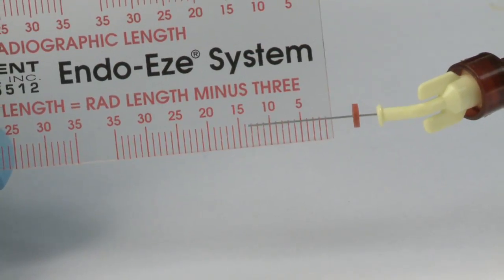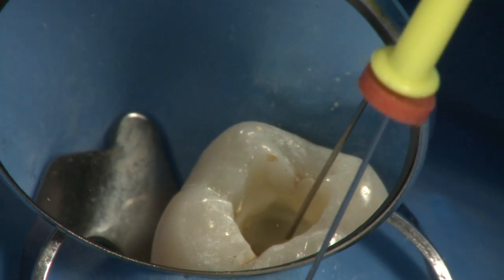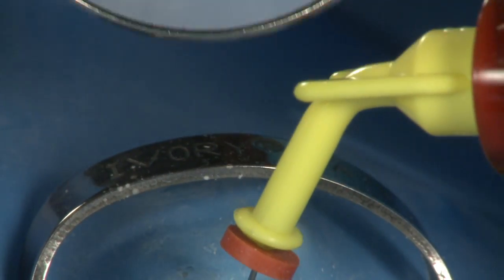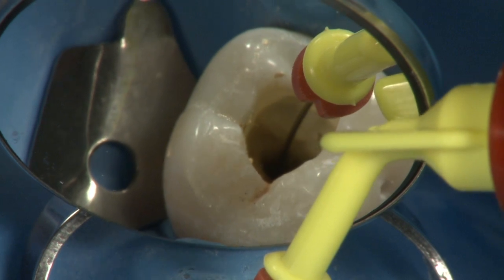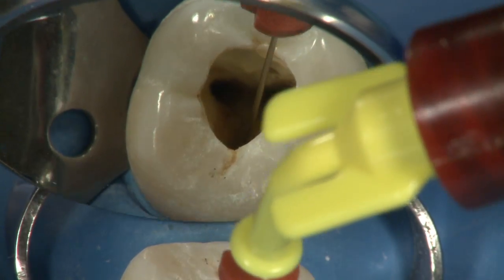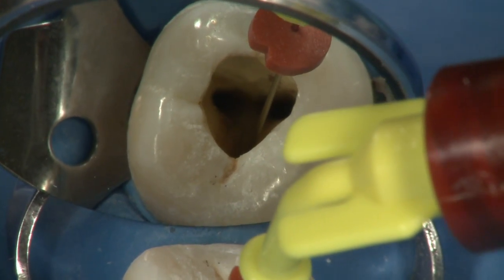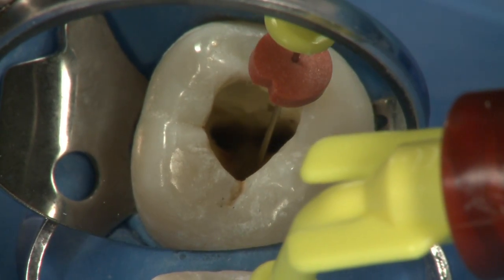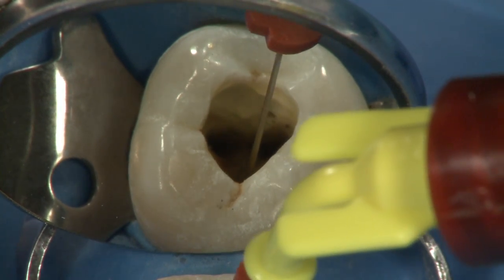Set the Navi tip silicone stopper 2 to 3 millimeters short of the working length. Be sure the Navi tip remains 2 to 3 millimeters shy of the apex and does not bind. Begin gently expressing EndoRes into the canal. Do not force the material out. Keep the tip of the Navi tip buried in EndoRes as you backfill the canal to eliminate the formation of air bubbles or voids as the canal fills. Caution: do not deliver EndoRes into the canal if the Navi tip fit is tight, as doing so may express EndoRes beyond the apex.